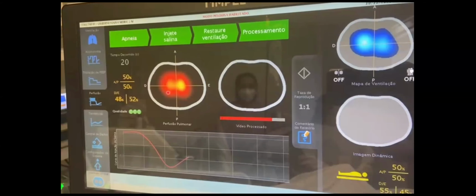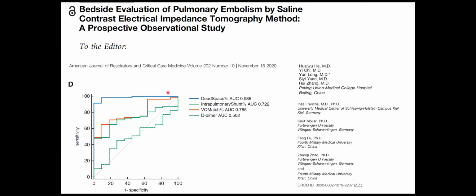So we consider that this patient was successfully thrombolyzed. And this is a very interesting aspect of EIT, that you can detect the problem and you can do the follow-up. And for this particular patient, our index of pulmonary emboli was about 2.5. So it was a very, very positive score, as we should expect.